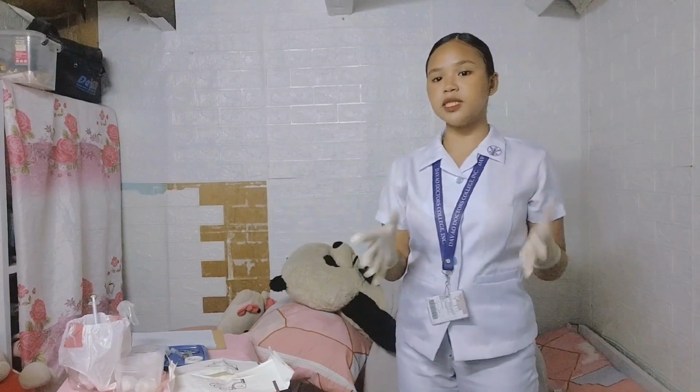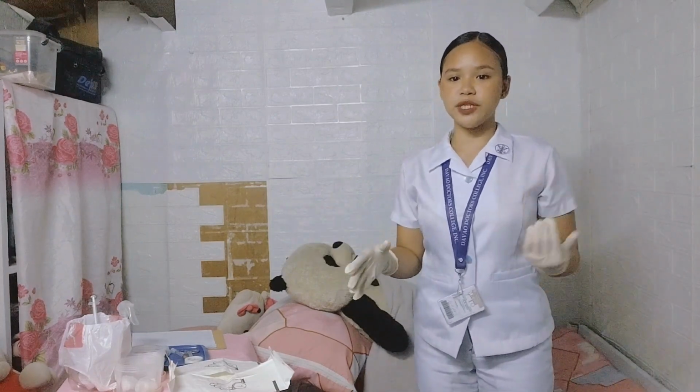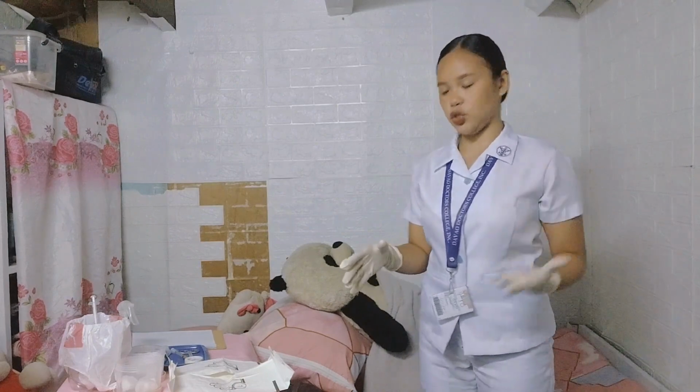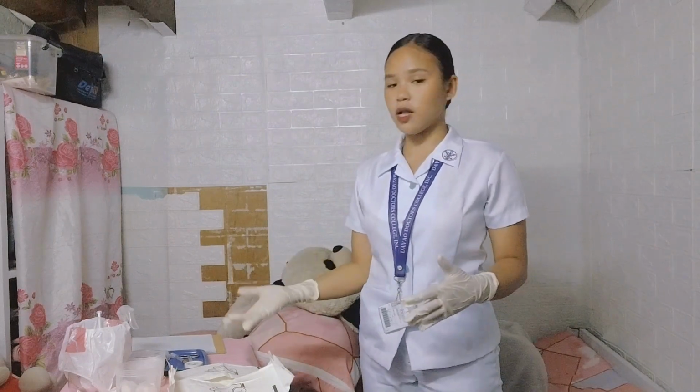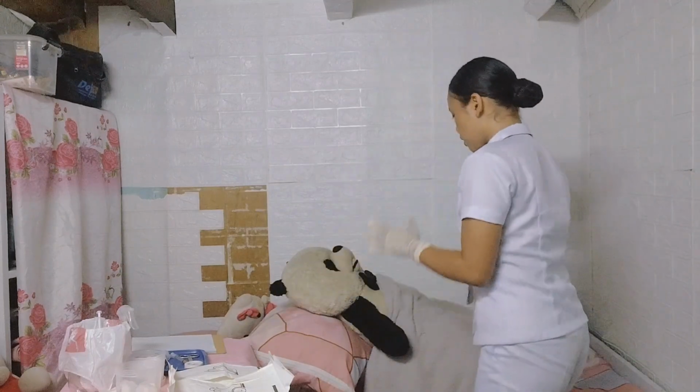Do not massage the area because massage can disperse the medication into the tissue. Now dispose the syringe and the needle into a sharps container. So, already dispose the syringe and the needle into the waste receptacle. And so, sir, we're done.